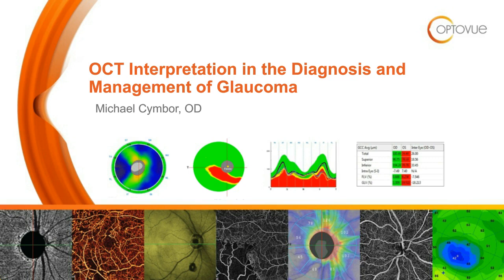I think a lot of us are experiencing that in glaucoma care. Exhilaration because we're in the midst of an OCT renaissance, but maybe feeling overwhelmed at times because OCT technology is changing so rapidly. And so part of tonight is to reinforce what you already know about glaucoma management when it comes to nerve fiber layer, maybe expand upon some of those ideas with the ganglion cell complex, and maybe get into some new areas in terms of angiography. So that's what we hope to accomplish tonight.